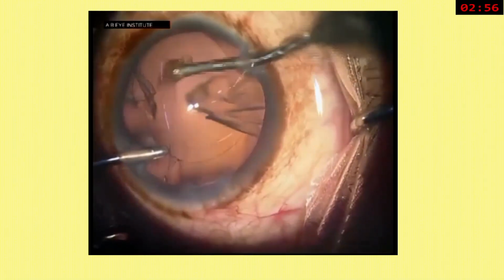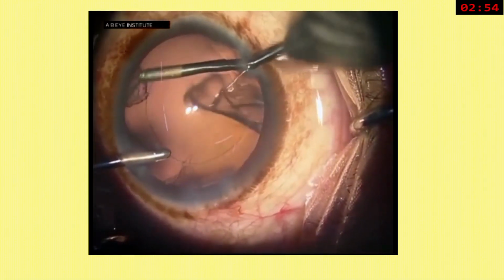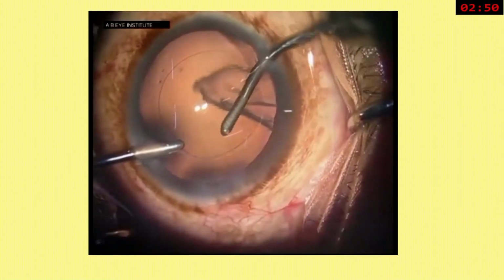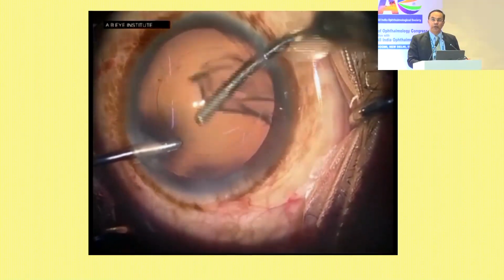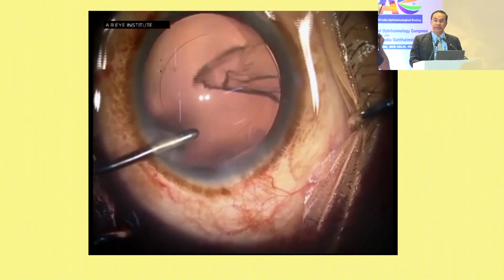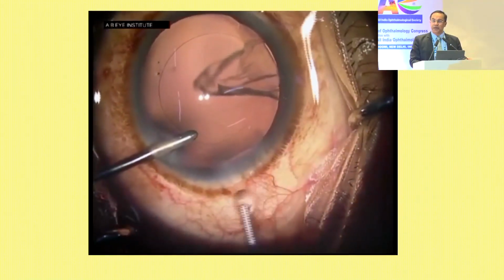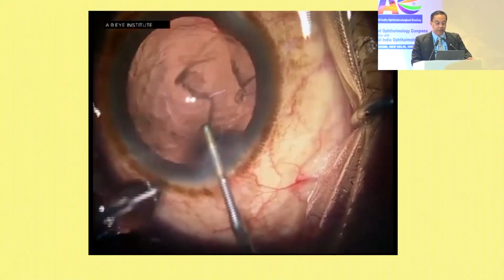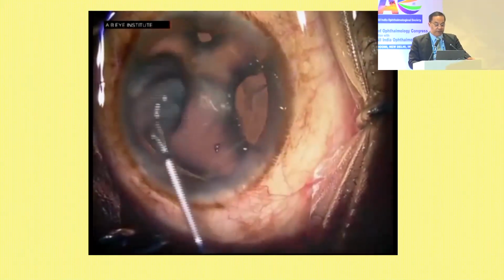So you're doing a perfect surgery. You are very happy with your axis. You have a little cortical matter left, and these are patients who are diabetics. You have controlled them. They are long-standing diabetics, and when everything is going normal, you don't have to worry about anything. But if something goes wrong, then a cascade starts, and complications go on becoming deeper and deeper, and that is when it becomes difficult to manage things.